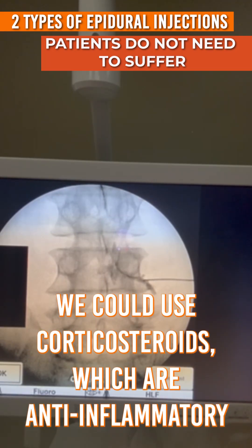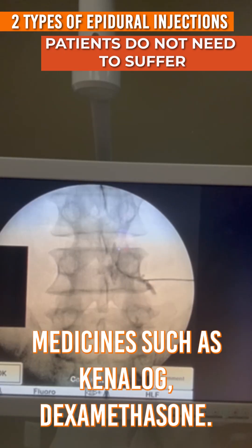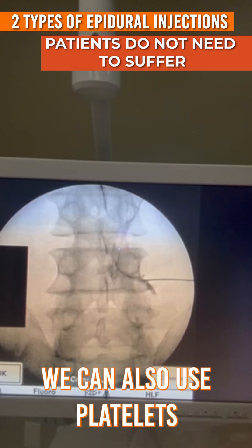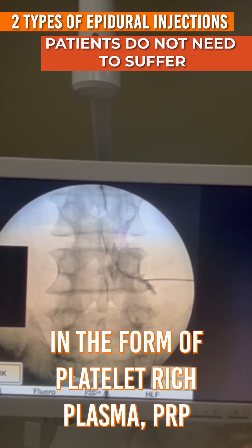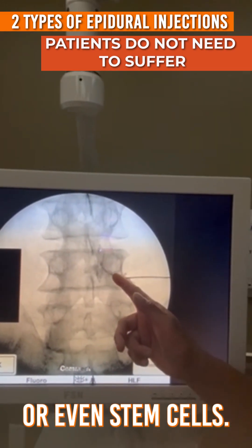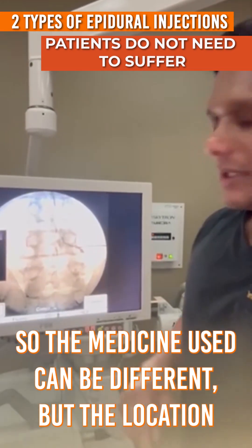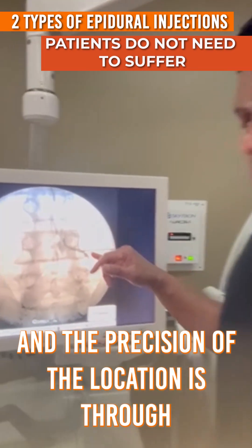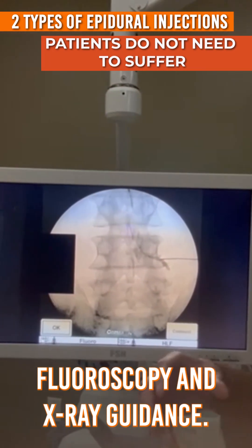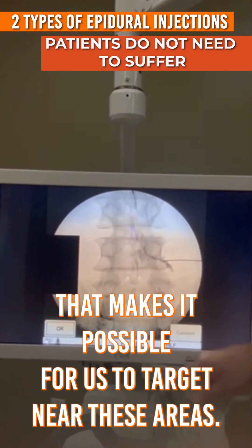We could use corticosteroids, which are anti-inflammatory medicines, such as Kenalog or dexamethasone. We can also use platelets in the form of platelet-rich plasma (PRP), or even stem cells. The medicine used can be different, but the precision of the location is through fluoroscopy and x-ray guidance, which makes it possible to target any of these areas.